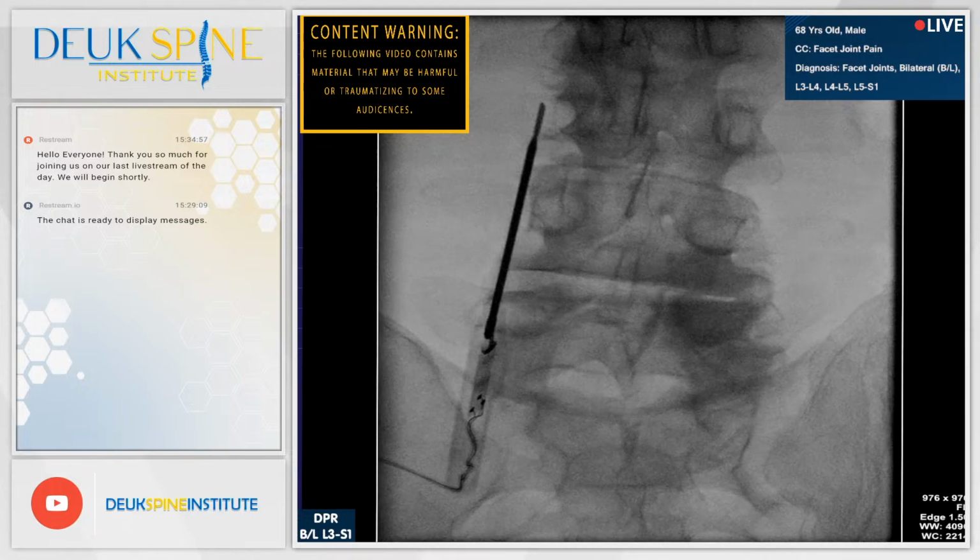Okay, we're literally perfect. Exactly where we want to be. And this is where the pain nerves run.